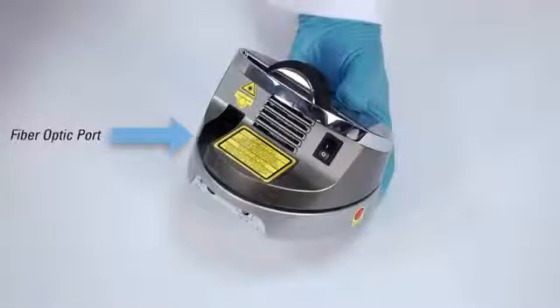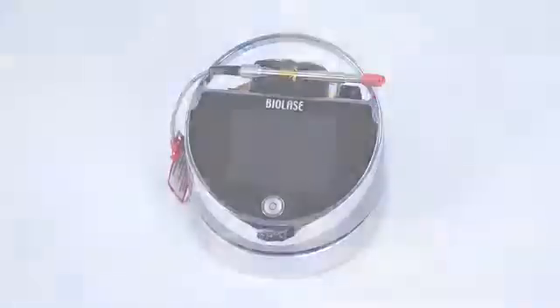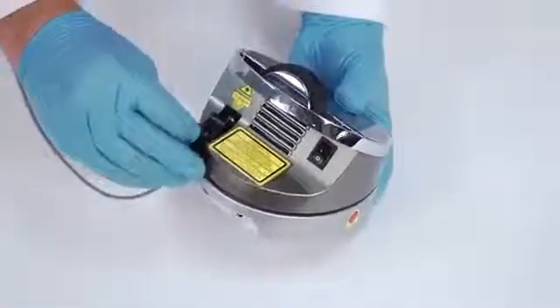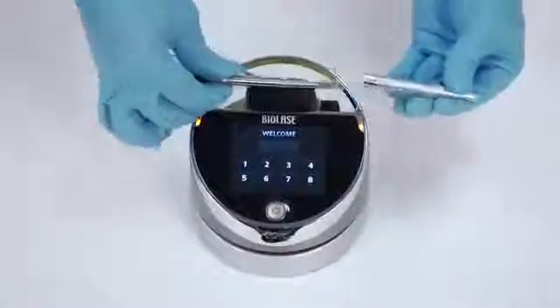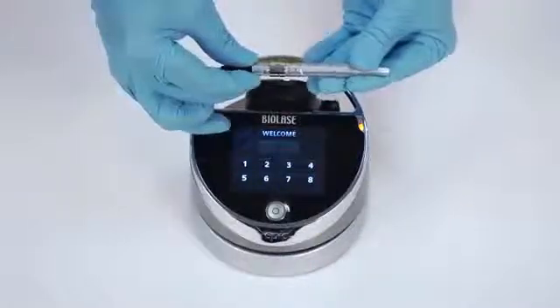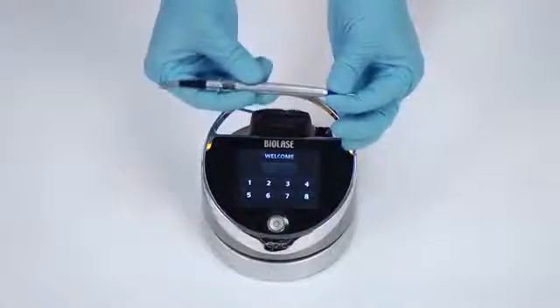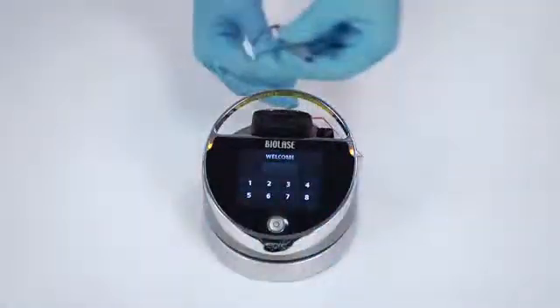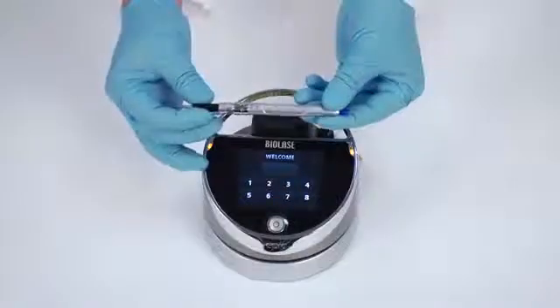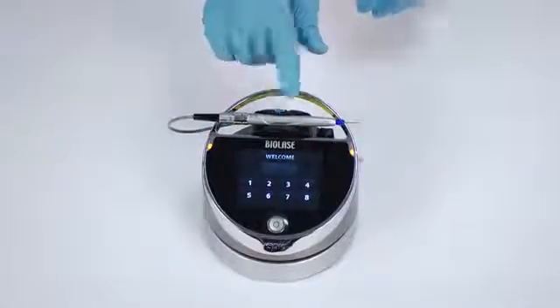Now it is time to connect the fiber optic delivery system to the EPIC. Note that your EPIC system may have shipped with the fiber optic delivery system already installed. If not, follow these instructions: insert the fiber optic assembly into the base of the EPIC unit, remove the protective cap from the end of the fiber shaft, carefully connect the handpiece to the fiber optic assembly, insert the selected tip and tighten it clockwise until snug, then wind any excess fiber optic cable onto the fiber spool counterclockwise around the base of the console. To store the handpiece, place it in the handpiece holder located at the top of the laser console.